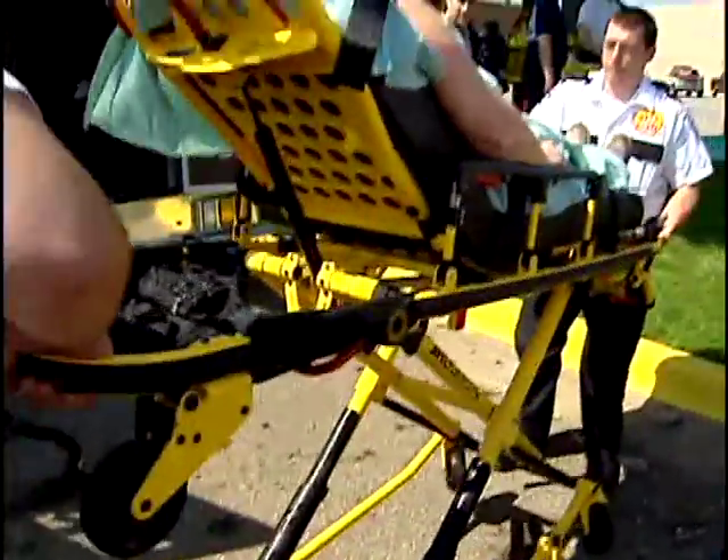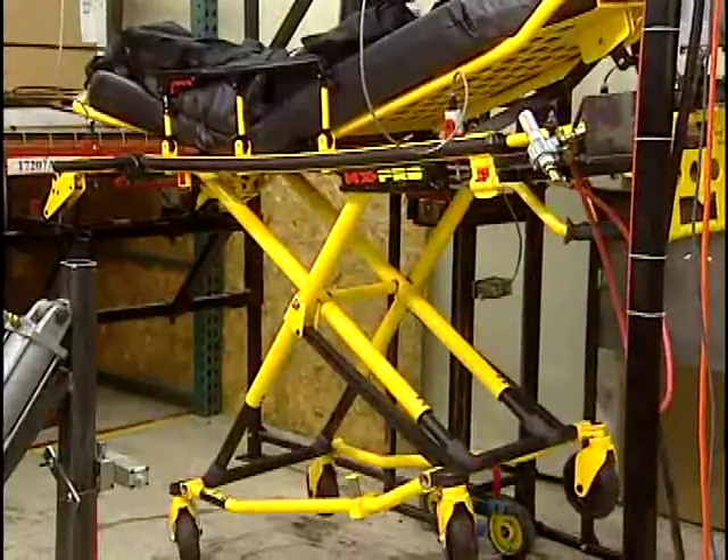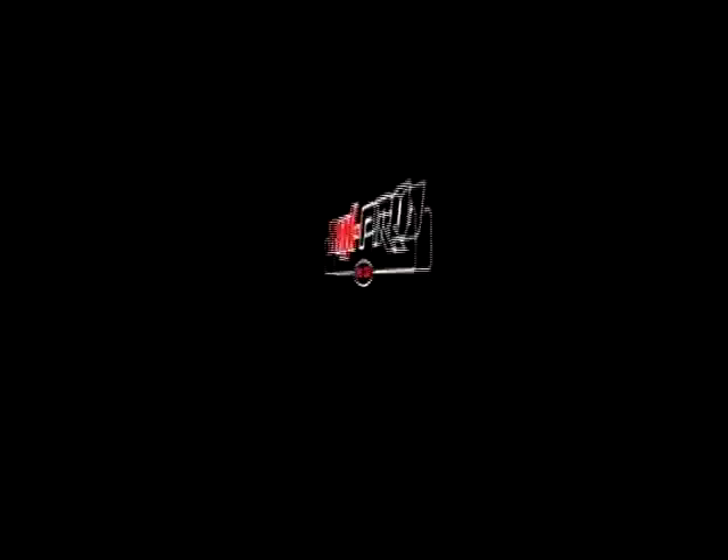They're designed to help you do your job. They're easy to use, and they're rugged enough to handle whatever it takes to do the job. But if you're new to Stryker, here's your chance to take a closer look.